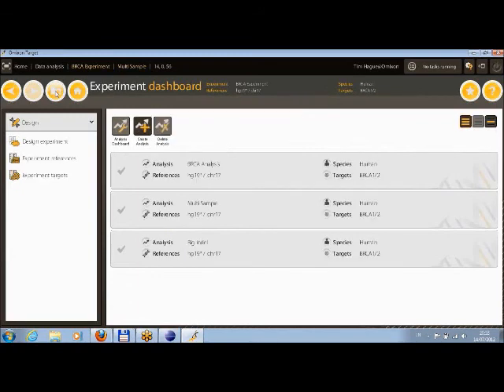So that's a very brief overview of some of the features within Omixon Target. I hope you've enjoyed the video.